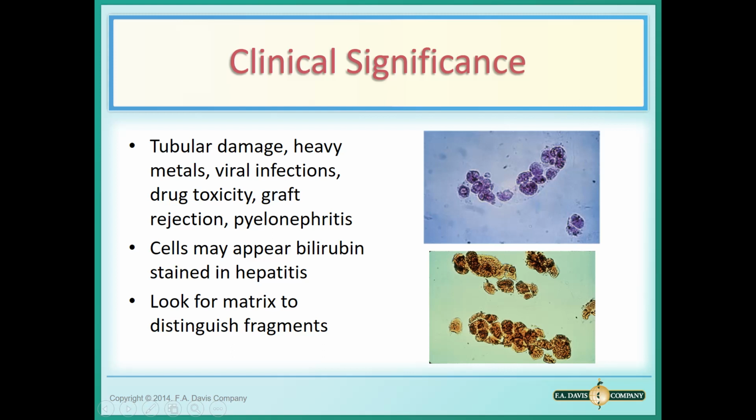The good news is that brownish color will point you towards some kind of a renal tubular. In this case, we would never think that brownish color was that dirty brown from a red cell, because that does not look like a red cell in a cast, right?